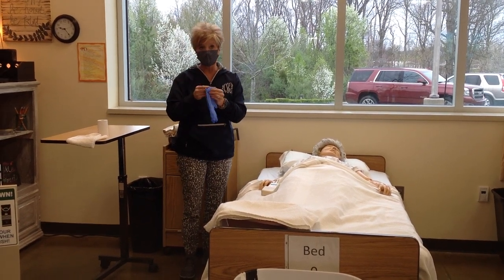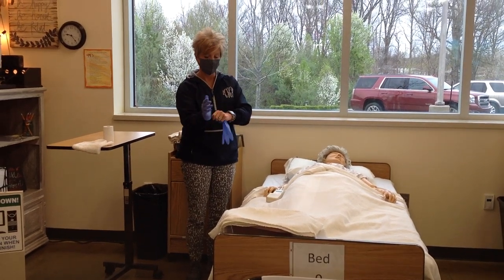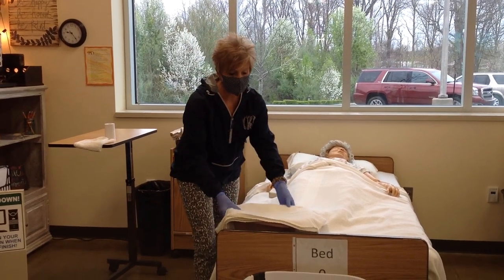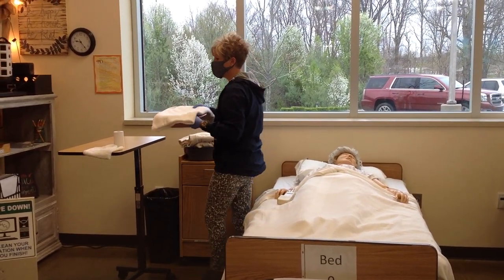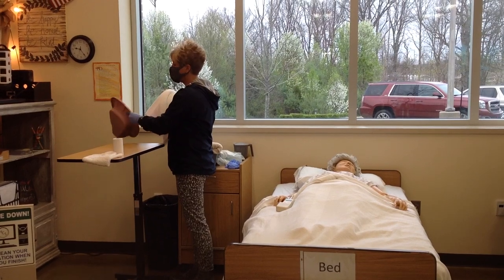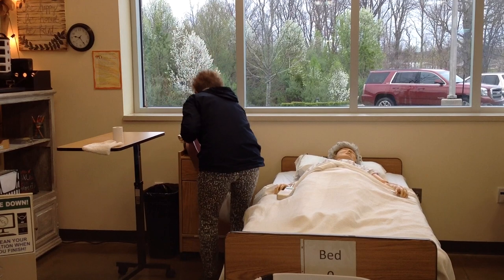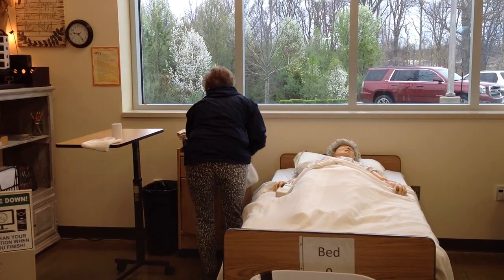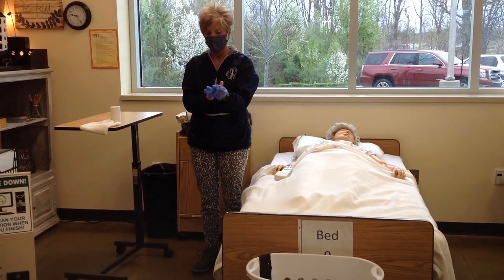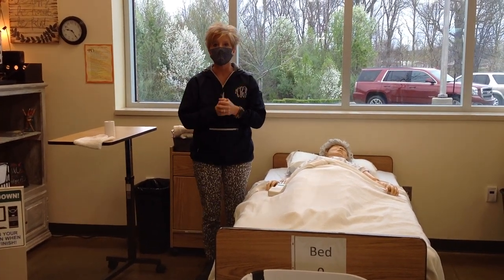Now I'm ready for the third section — third pair of gloves. I'm going to take the bedpan to the bathroom. If they were on intake and output, I would measure it. If not, I'm going to dump it in the commode, wash it out, dry it, then store it in the bottom drawer of the bedside stand. I'm going to remove my gloves, dispose of those, wash my hands, and report.